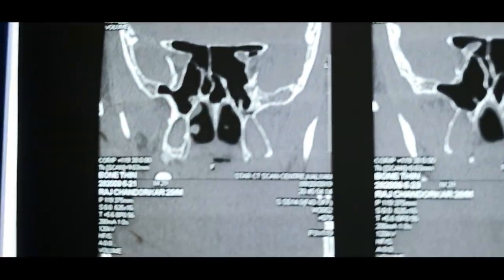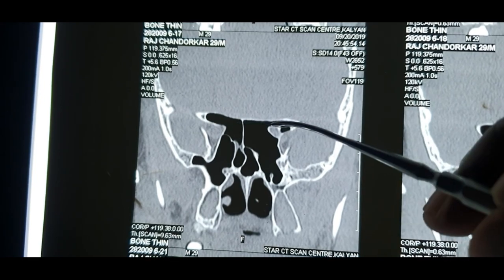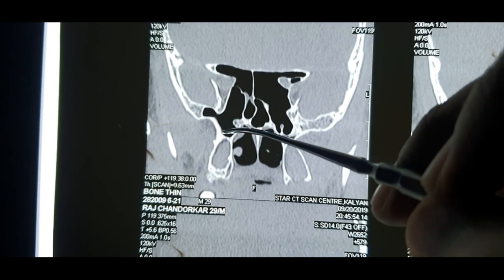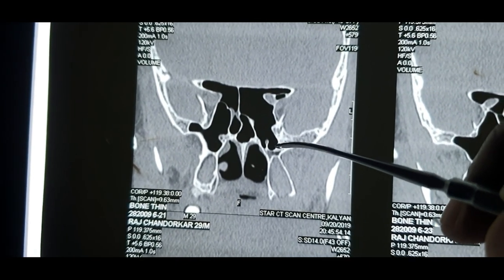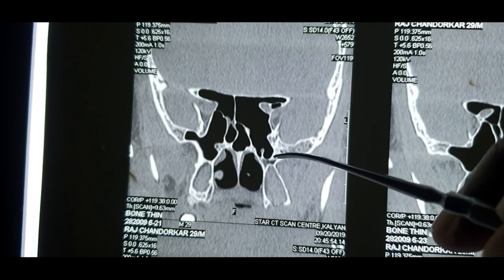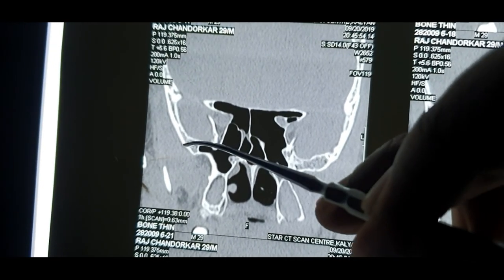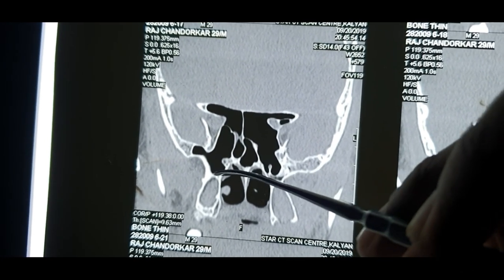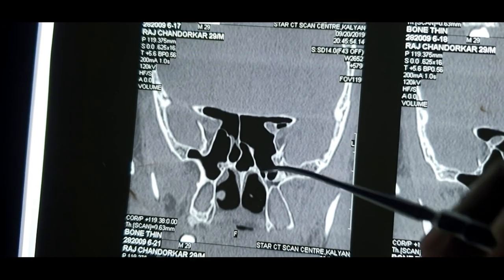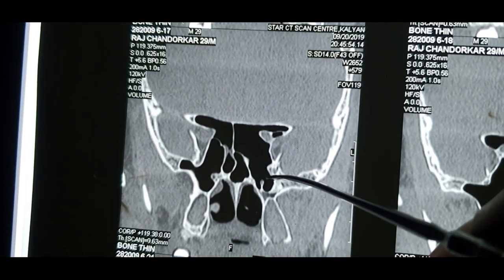So as I was saying, in this scan right now, this entire scan is of sphenoid bone. As I said, lesser wing, this is greater wing, this is the sphenoid sinus proper, this is the area of the pterygoid body, that is also called a pterygoid wedge, in the center, but there has been excess lateral pneumatization. See, this is a greater wing of sphenoid. The area here was the area of the pterygoid wedge or the pterygoid body, and this is the area of the greater wing of sphenoid. Now this is called the lateral recess of sphenoid.